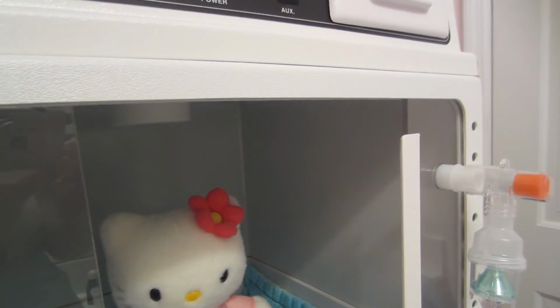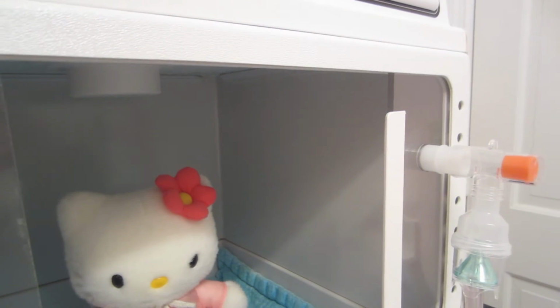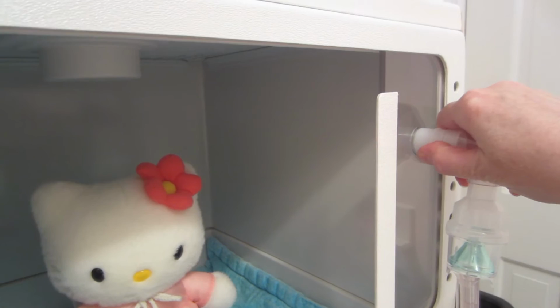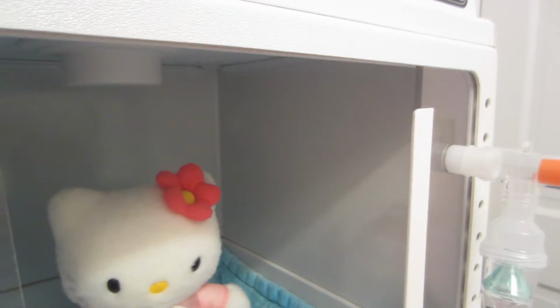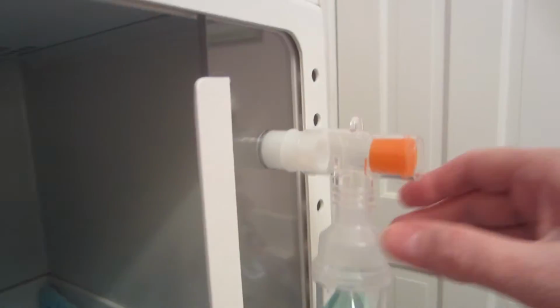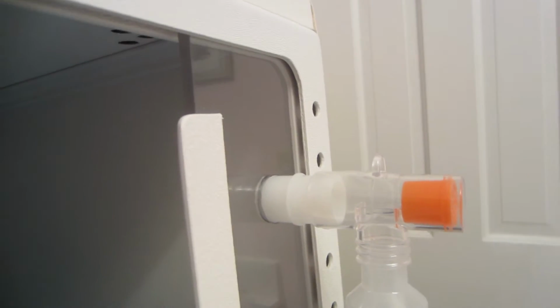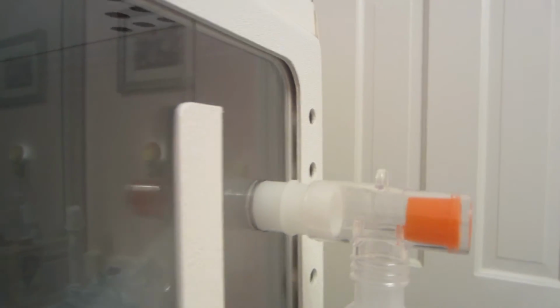You can use a storage container and cut a hole in it so that your nebulizer will then fit through the hole. If you use a carrier and wrap it with plastic or towels, you're going to have to hold the nebulizer in position so that you get all the mist into your nebulizing chamber. But anyway, this incubator has a special little door attachment for nebulizing, and that's what I am using. And then the regular door just kind of slides into position and makes it airtight for me.